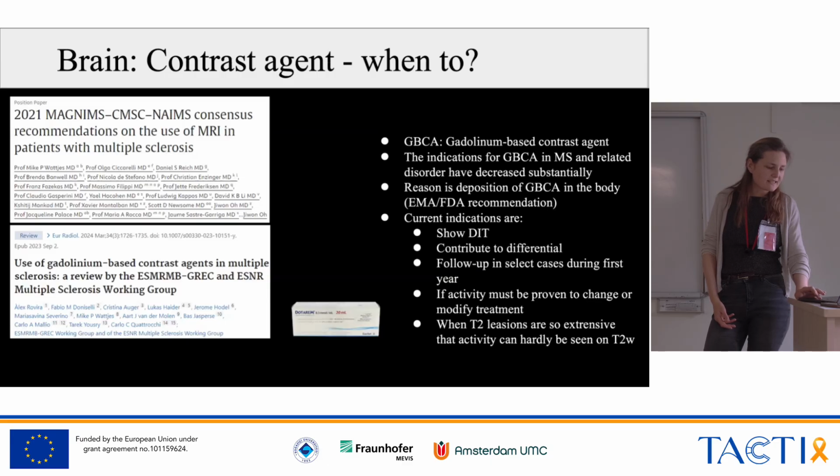Contrast agent, of course, gets injected, and in fact, the tolerance for gadolinium contrast is very good. So the toxicity is very low and allergies are very low. You cannot give it during pregnancy, or at least you have to warn the woman that it's not good for her baby. Sorry for the question.